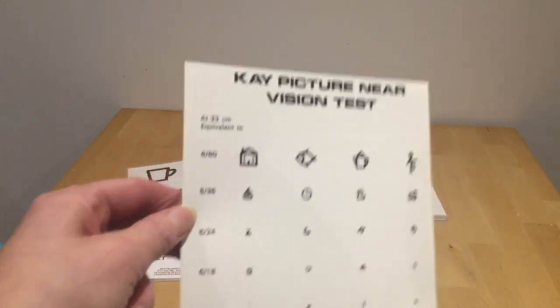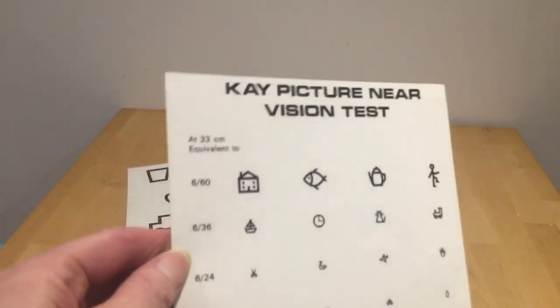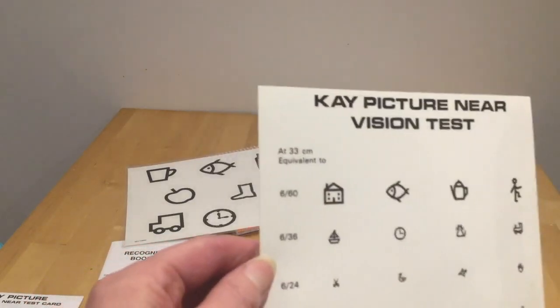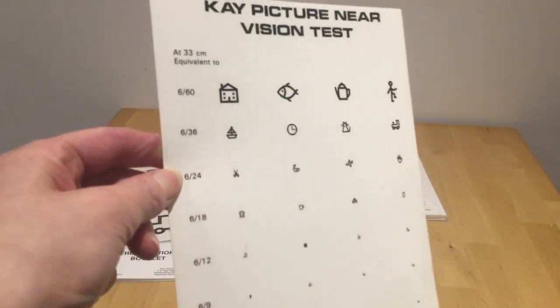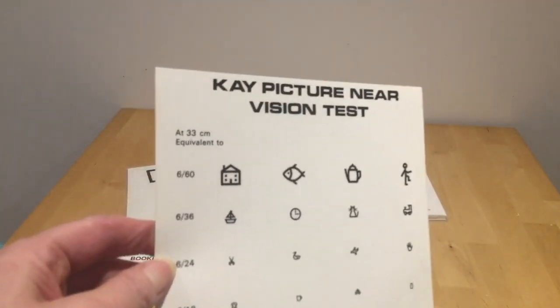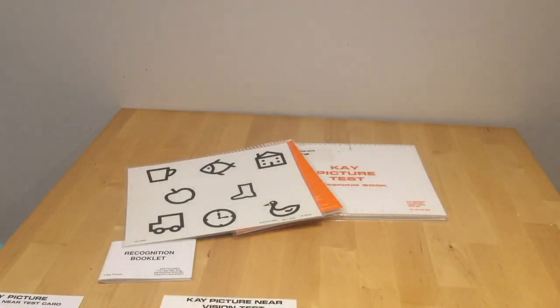You'll notice in other near tests, although as I've said, this is not a near test, it was about the child going as close as they wanted. If you weren't at 33 centimetres, you would invalidate the scores down the side. So just that is something to be aware of. I should have also said, when I'm testing at 3 metres or at 6 metres, you can have a piece of string in your bag and have it knotted at 3 metres and 6 metres to make sure that you get the distance correct. I tend not to do that because I'm doing a functional assessment, so I would just measure out 6 metres by taking 6 long strides, which I think are about a metre each.